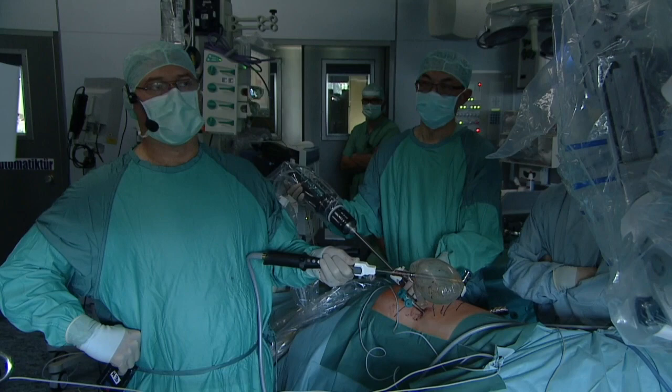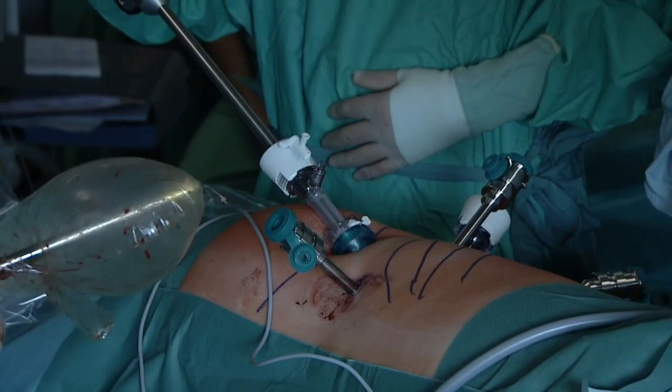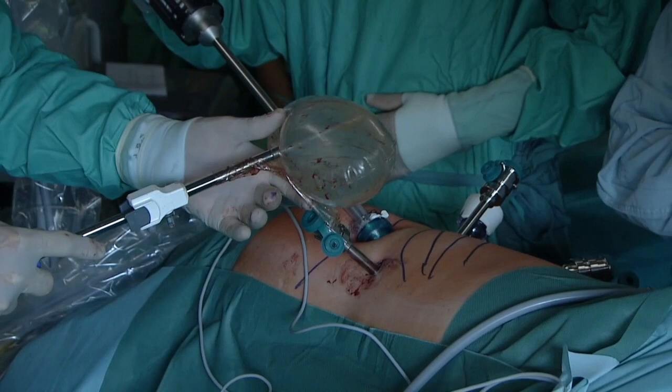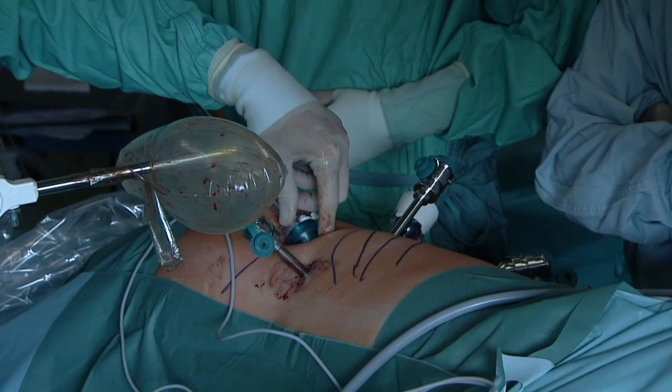Okay, great. So what I'd like to do is show you our port placement before we dock. So if we can have our view of the ports. Before I put the ports in, I use this balloon dilator, which accepts air. We've insufflated in this direction to create the retroperitoneal space. This was placed through an incision in the mid-axillary line just above the iliac crest.